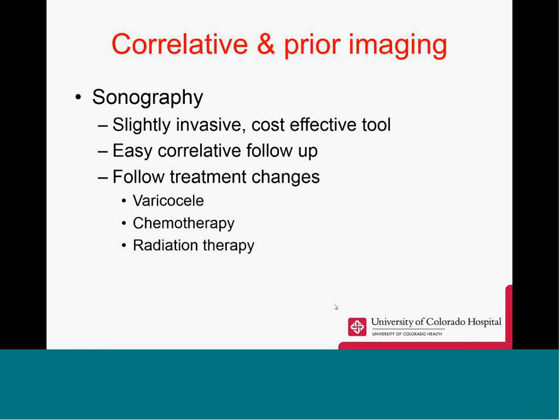To close out here, sonography is a minimally invasive, cost-effective tool. It has easy correlative follow-up. We can also follow treatment changes in different pathological states such as varicocele treatment, chemotherapy, or radiation therapy.